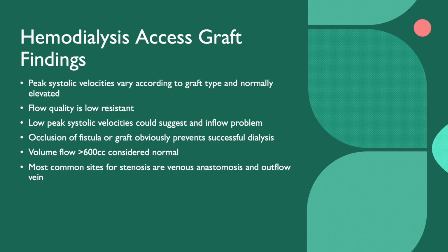All right, and again, we're going to do peak systolic velocities on these. You're going to check for occlusion sometimes, and this is why when I have one of these patients, I always feel with my hands first to see whether I think, is it a basilic, like more on the inner arm, the medial, or is it cephalic? Is it more on the outer arm?